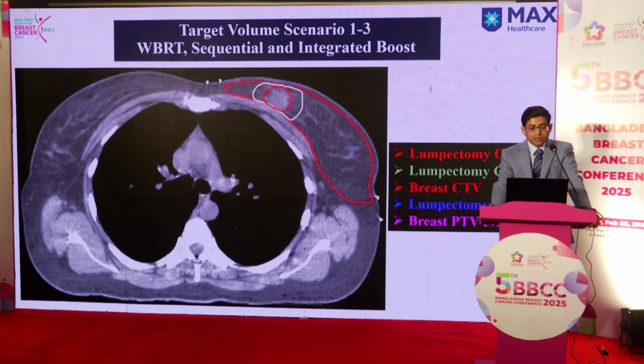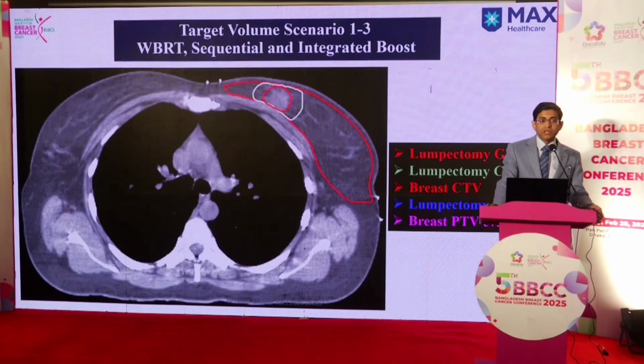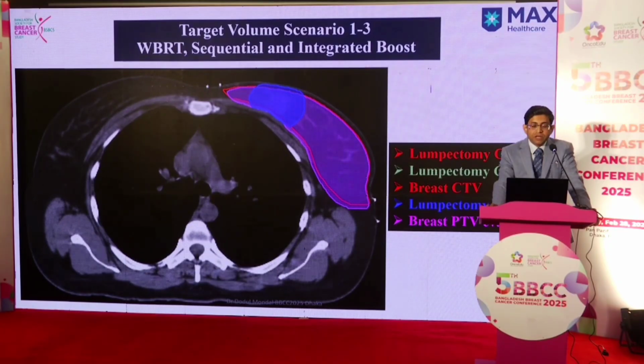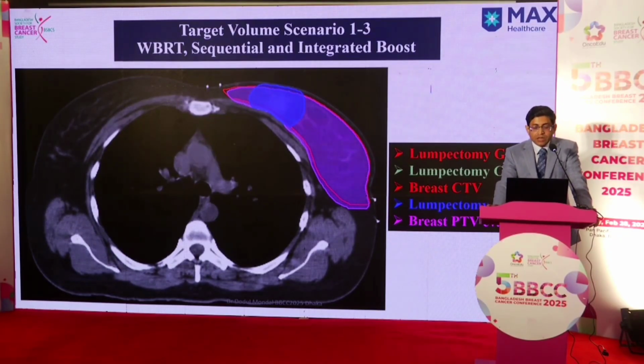You can actually see here the fiducials and also the clinical breast marking by copper wire, and you can see that there are not many artifacts when we use copper wire. Make sure that the CTV is edited off from the skin for early breast cancer by 5 mm, and usually we avoid sharp angles, because when you create a lot of sharp angles and irregular contours, it becomes difficult for the software to optimize. So make sure that you give a fine and smooth contour after all these maneuverings. In our center, we use a 5 mm to 7 mm PTV depending on the movement, and we edit off the PTV from the skin by 5 mm, and then we create that PTV eval as a structure where we optimize the dose.